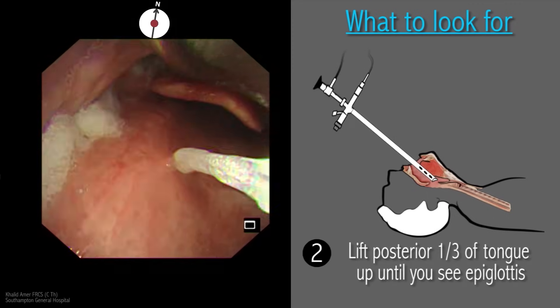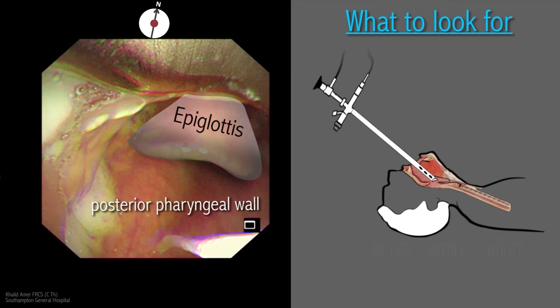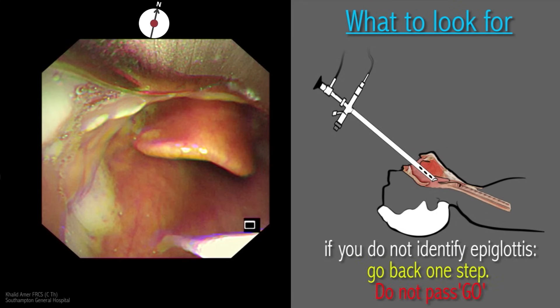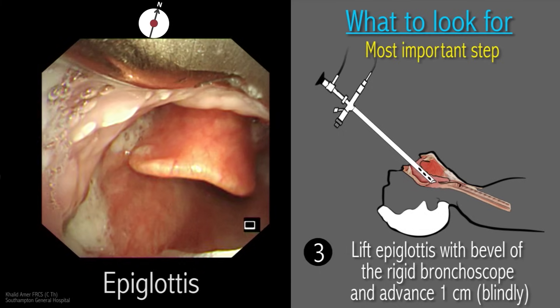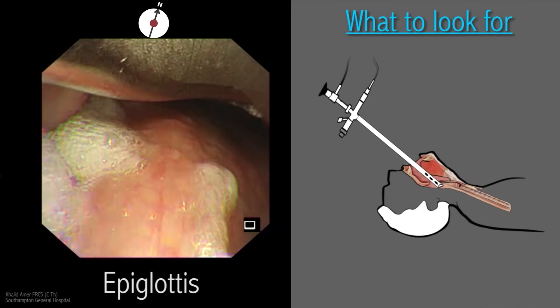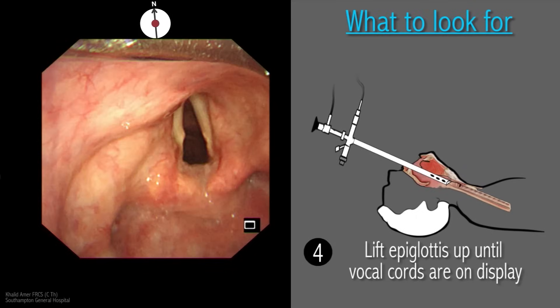The next step is crucial to entering the trachea, so pay particular attention. Lifting up the posterior third of the tongue exposes the epiglottis. The bevel of the rigid scope is then introduced for a centimeter or so under the epiglottis and the latter is lifted up while keeping the scope in the median line. Note that this is a blind move — if the epiglottis is lifted successfully, it will not be seen again. Sometimes the epiglottis is very floppy and difficult to lift. However, this is a crucial step, and if the epiglottis isn't identified or not lifted up successfully, you should not proceed. Go back one step and try again.